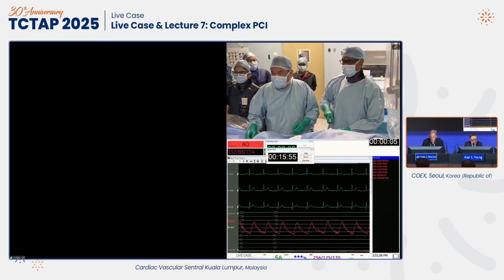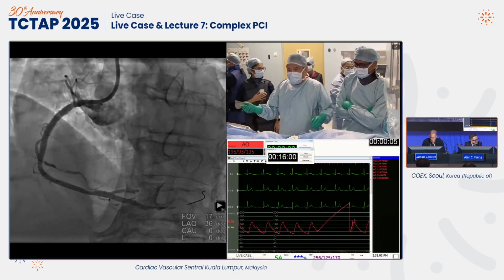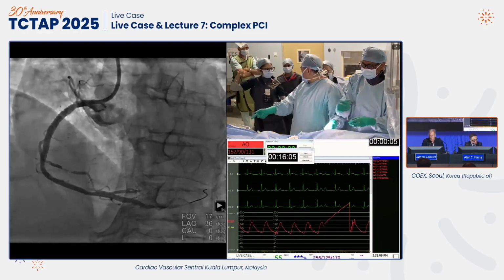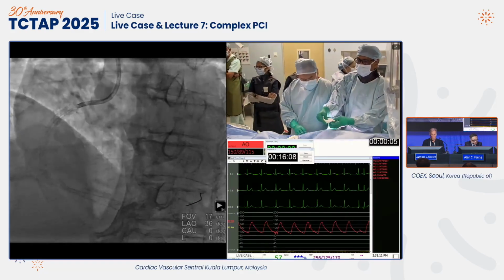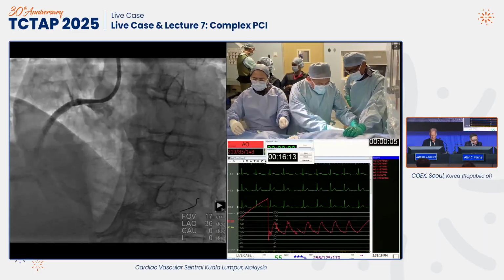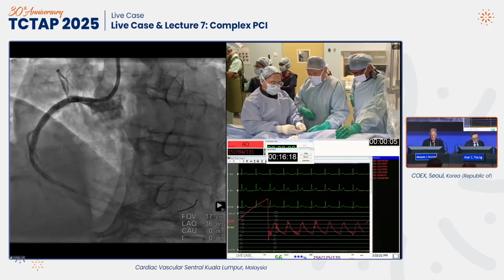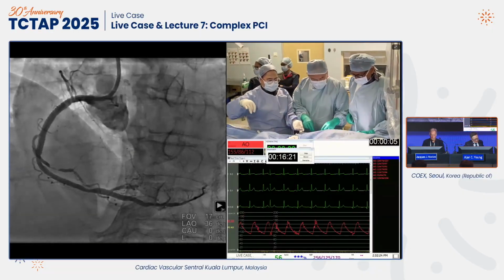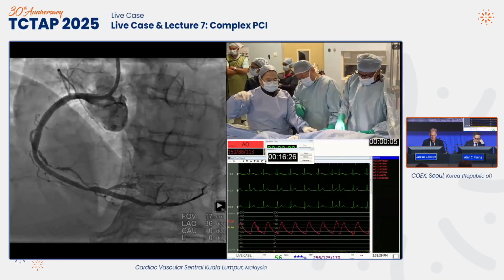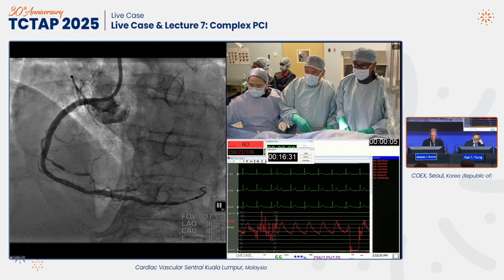But the interesting thing is to call it lithotripsy or mechanical lithotripsy. I'm not sure what mechanical lithotripsy means, because lithotripsy by definition is using sound waves to create a shock wave type of thing. So obviously marketing-wise, litho makes sense, but it is a different type of phenomenon, I presume. Yeah, it's mechanical because with sound wave, there's an external source, the ultrasound wave, to try to break, but this is by contact. There's no external source to introduce power to break it.